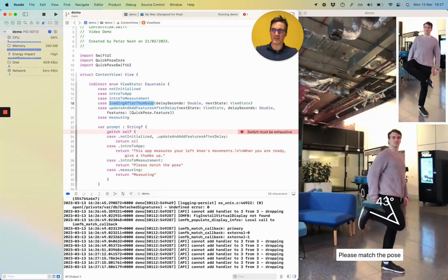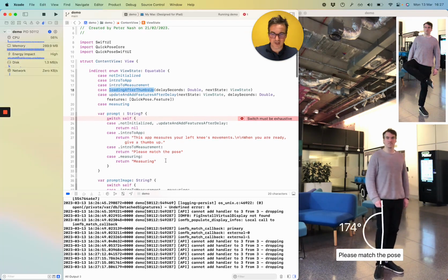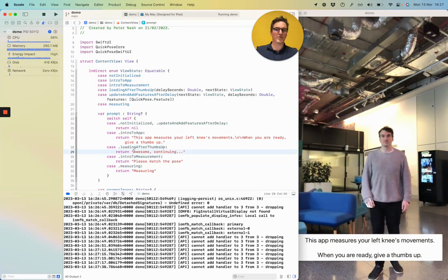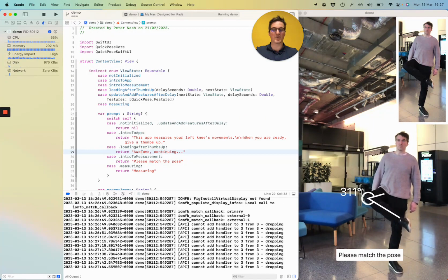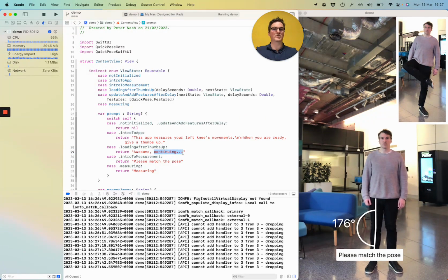So this is quite a specific case. It's before "please match pose." I'm going to say loading after thumbs up. I've tried a few messages here, like "great" and "done" and things like that, but it's useful to acknowledge the user's thumbs up and then to say what's happening now. So it's going to continue.